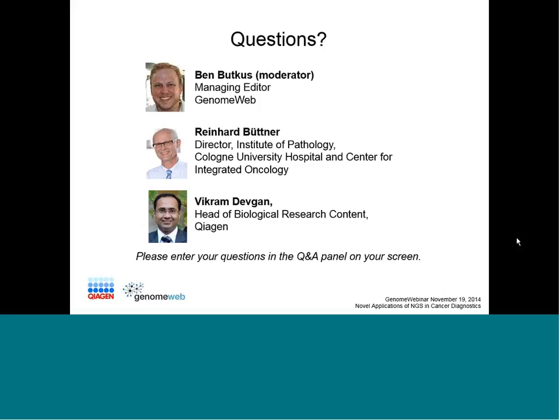Well, it's a difficult question, and it shows that even such a good old gene like EGFR, which has probably been sequenced 100,000 times all over the world, poses new questions in daily histological practice. I think there are different types of insertions, and a good data library to go to is the COSMIC library and also the cBioPortal from Memorial Sloan Kettering, the Chris Sander library, and check, there's information on the modality of the insertions.